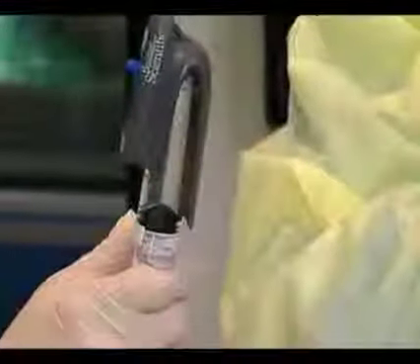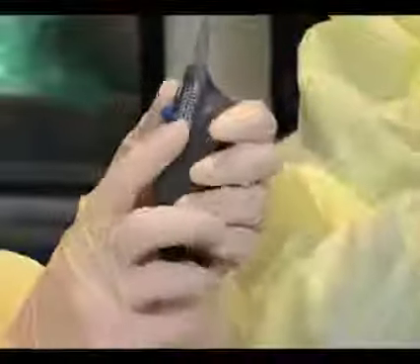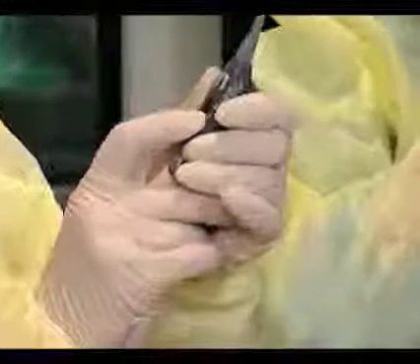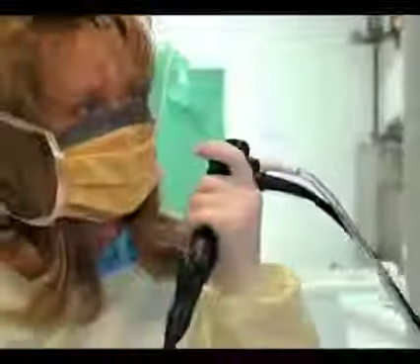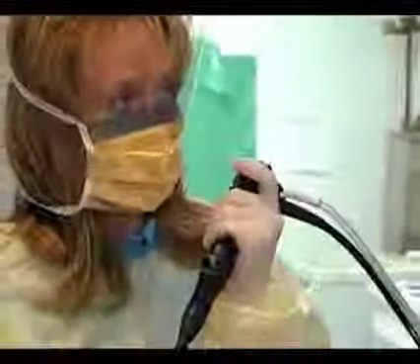And then once it's been 30 seconds, I ask my assistant to place the needle in. Needle in. I communicate that. She communicates back to me. Then I just confirm with the camera that my needle indeed is back in its working sheath, and it is, so as not to cause any damage to the scope. And so I'm just going to pull it through for specimen collection in one straight pull, so as not to damage the needle or the scope.